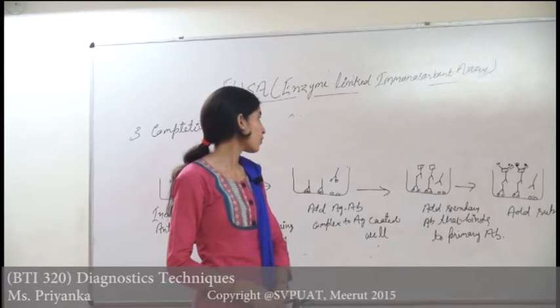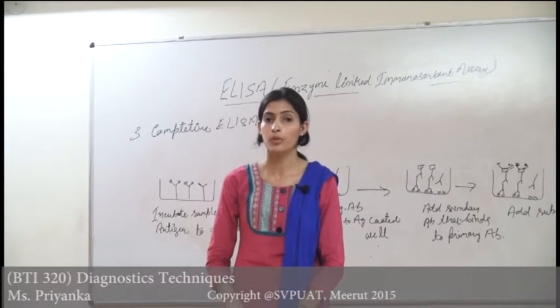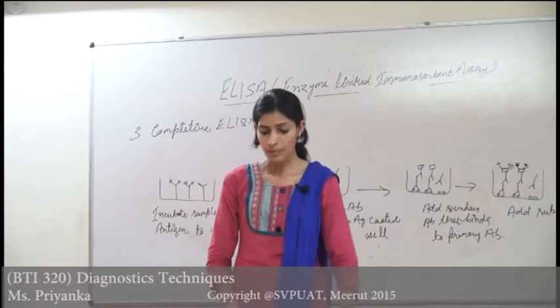So these are three types of ELISA that can be used for measuring either antigen or antibody in our sample. Now, applications of ELISA.